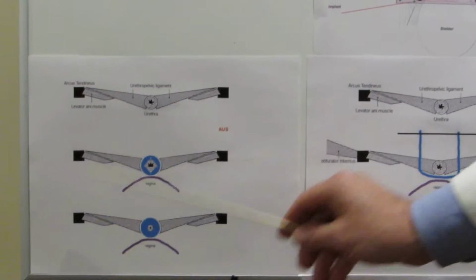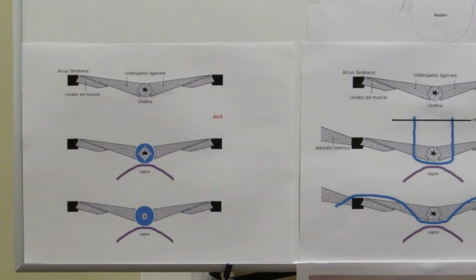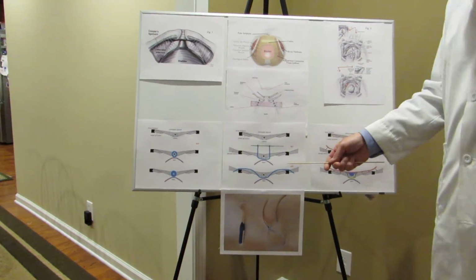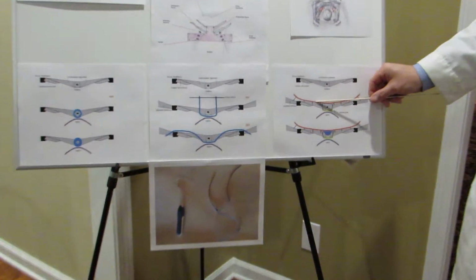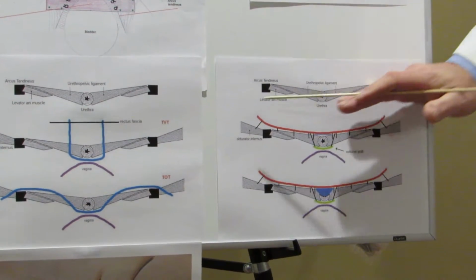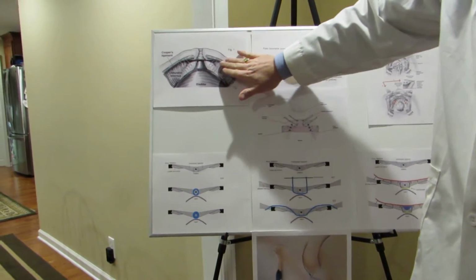Again, that's the artificial urinary sphincter, a cross section of where it would sit in the pelvis. My proposed implant, or a new treatment option for lateral defects of the pelvis as well as incontinence, would be to place an implant on top of this entire plane without ever perforating, and you basically restore continuity of this entire area all the way out to here, and all the way out to here.